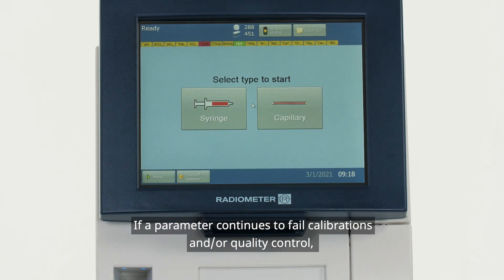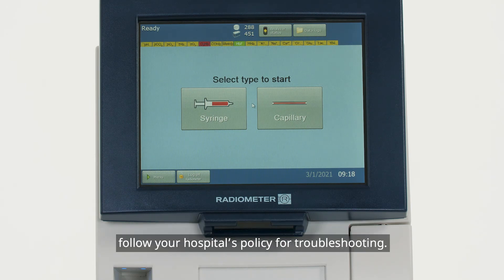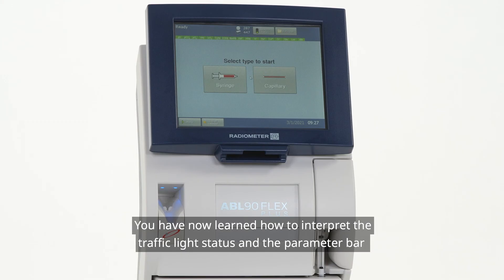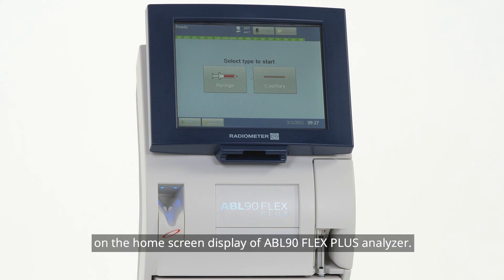If a parameter continues to fail calibrations and/or quality control, follow your hospital's policy for troubleshooting. You have now learned how to interpret the traffic light status and the parameter bar on the home screen display of the ABL90 FlexPlus Analyzer.